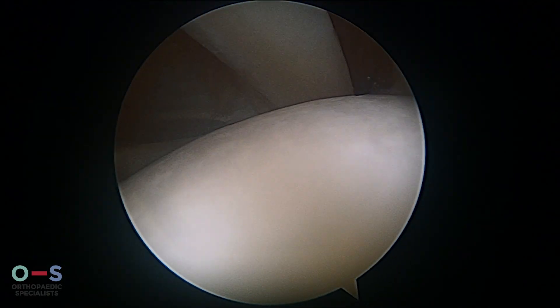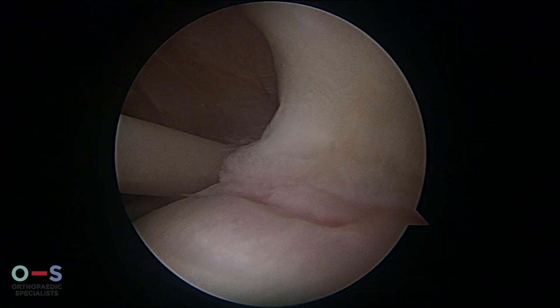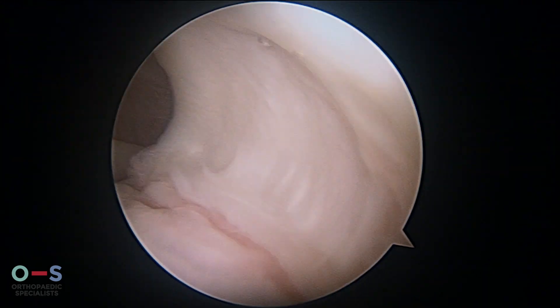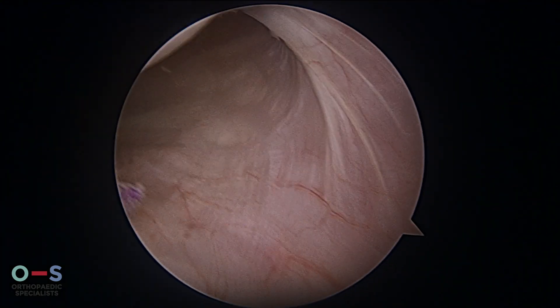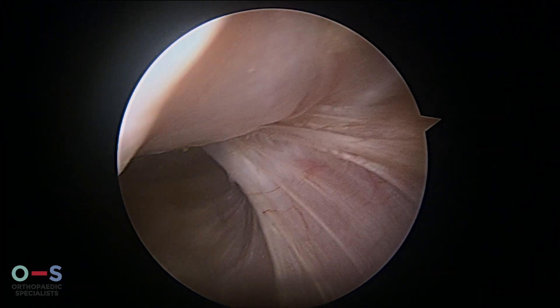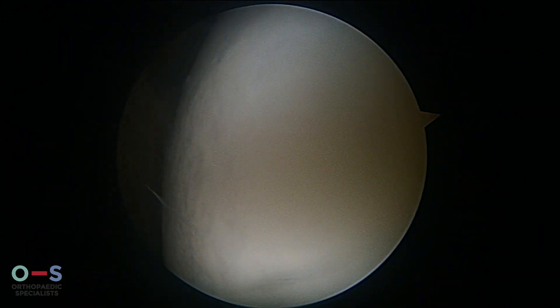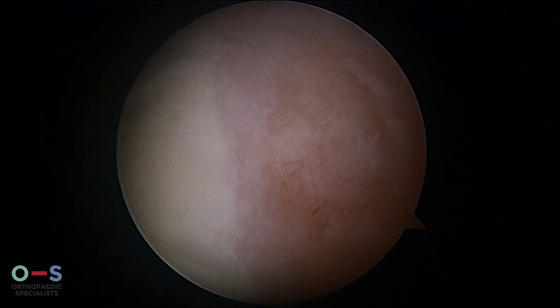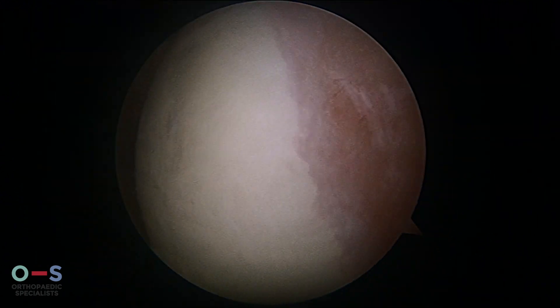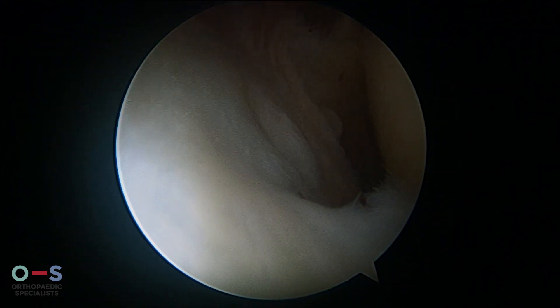Here is an inside view of the patient's shoulder. We are looking at various structures including the supraspinatus tendon, the inferior capsule. The round structure you'll see now is the humeral head, and on the left hand side of the screen you will see what's called the glenoid.